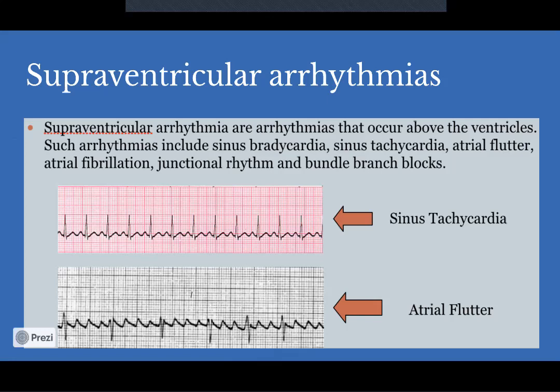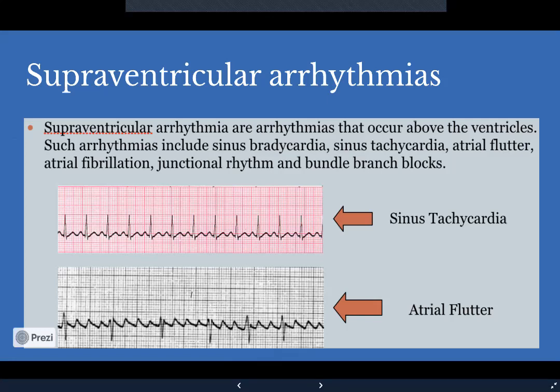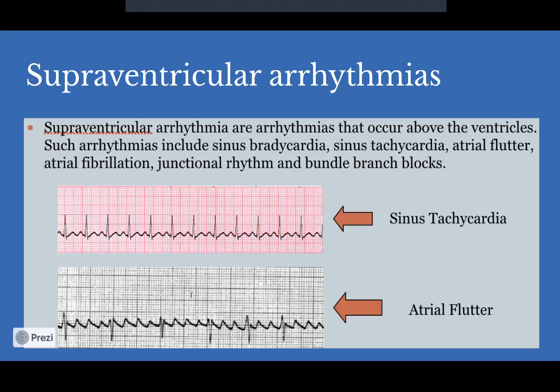So we did our heart rate. So say it's a 25 millimeter per second. So we do 1, 2, 3, 4, 5, and so on. So I just did 4 seconds for fun. So 60 divided by 4 is 15, right?